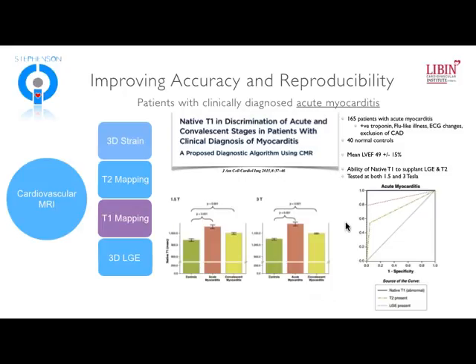The second paper that I will mention with native T1 mapping is one that came out this year, and is one that is very valuable actually, because it studied patients both at 1.5 Tesla and at 3 Tesla. It was done in 165 patients with acute myocarditis defined by clinical criteria, and that was a positive troponin with a flu-like illness, with ECG changes, and exclusion of CAD. And they have 40 normal controls. And you can see that this is a slightly sicker patient population.